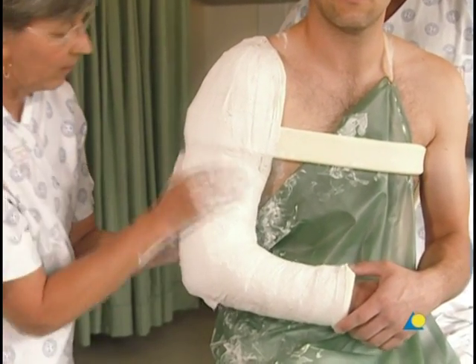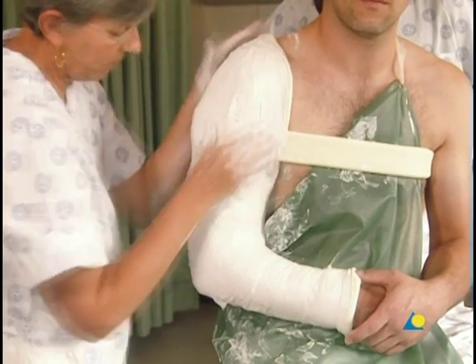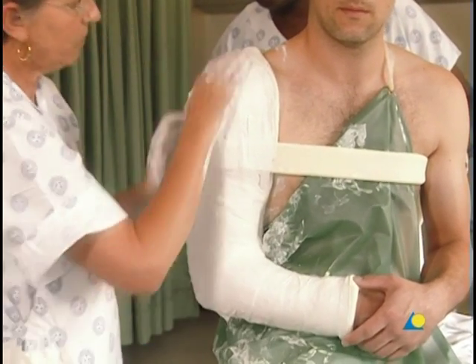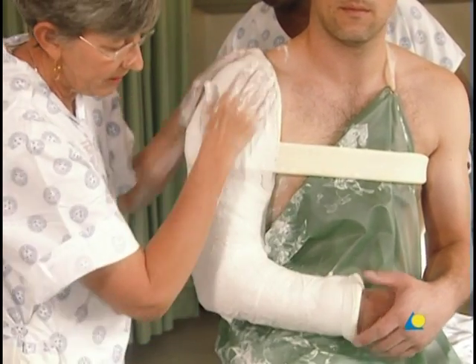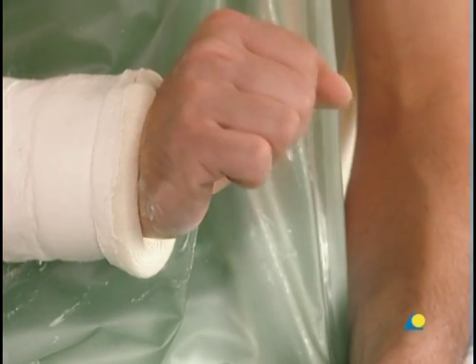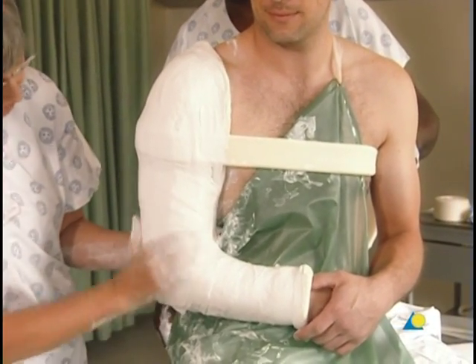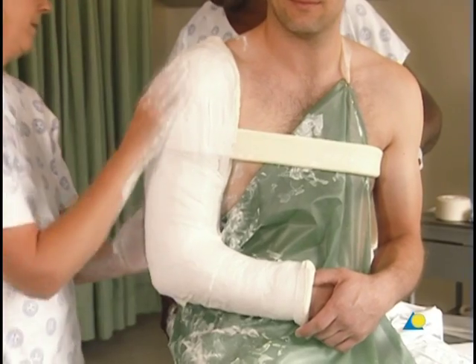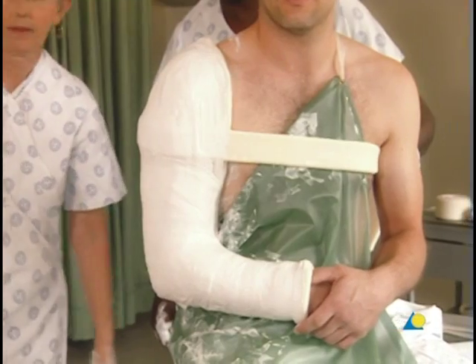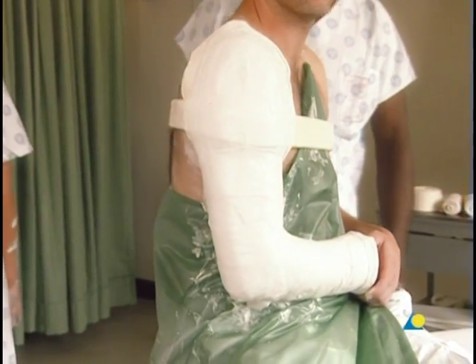An additional plaster bandage is applied to secure the cotton sponge and is molded as shown. The extension of the patient's wrist is checked to ensure that no nerve damage has occurred while reducing the fracture. The application of the modified shoulder splint is now complete. The reduction may be verified with an x-ray.